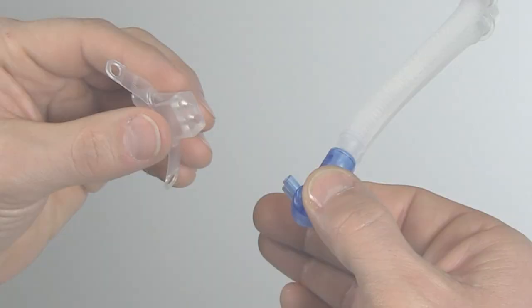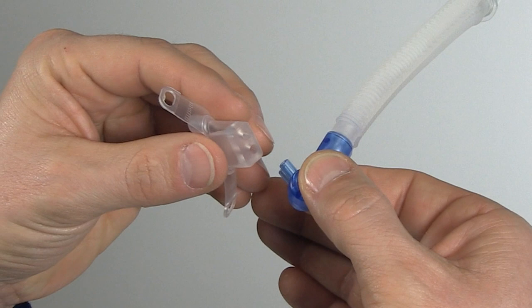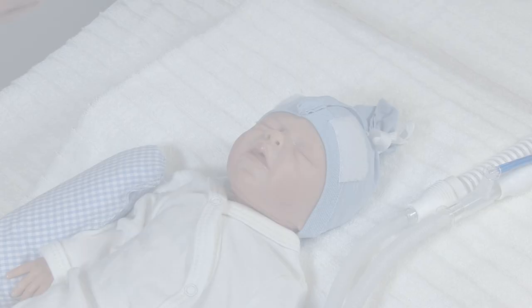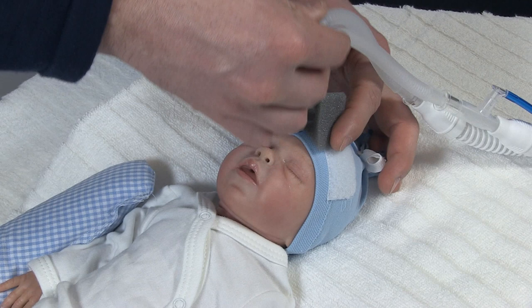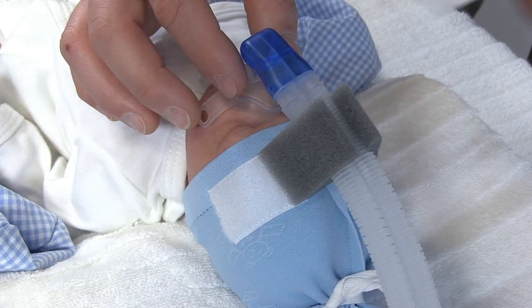In this case, we have decided to use a mask. Mount the mask or prongs on the NC-PAP generator. Note that the angle at which the mask is mounted on the generator can be adjusted if necessary. Now take the fixation pillow and put it between the two velcro strips on top of the bonnet. Place the generator tubes into the opening of the fixation pillow and close the velcro strap tightly over the tubes.